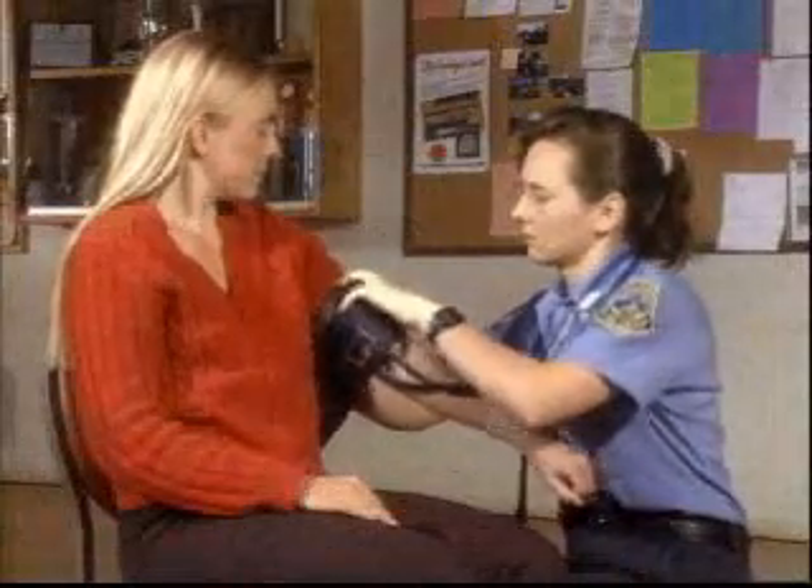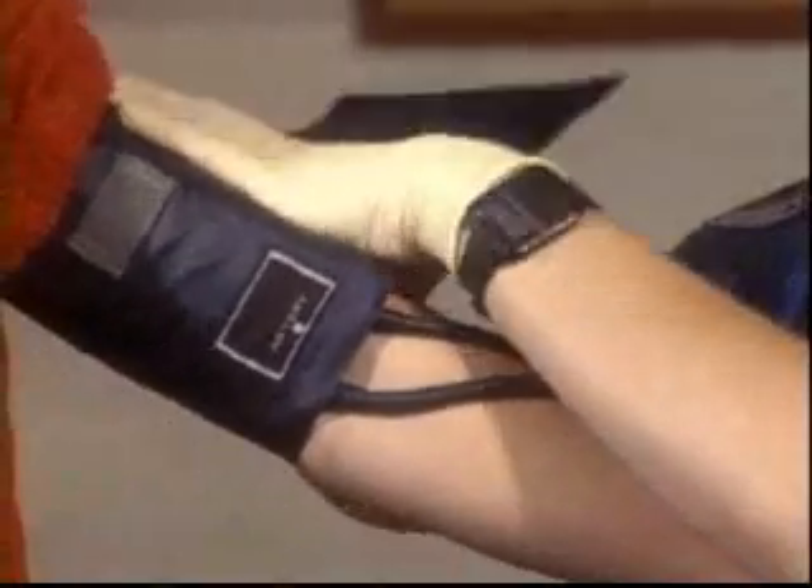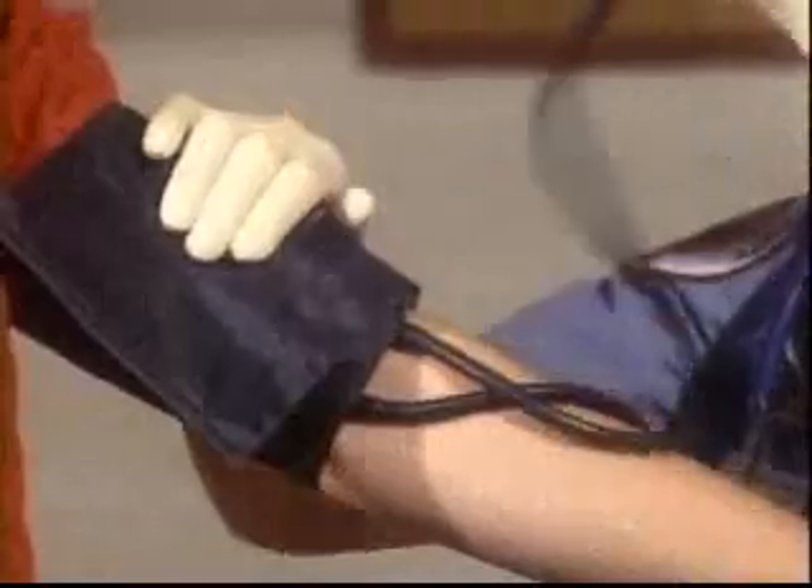First, choose the correct size cuff for the patient's arm. Put the cuff around the upper arm, with the cuff mark at the medial side of the biceps brachii, about an inch above the anterior elbow.